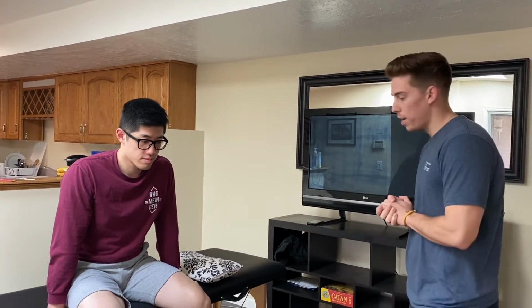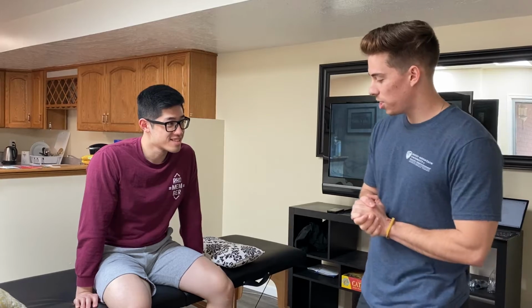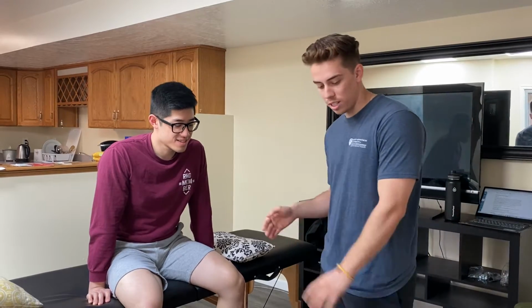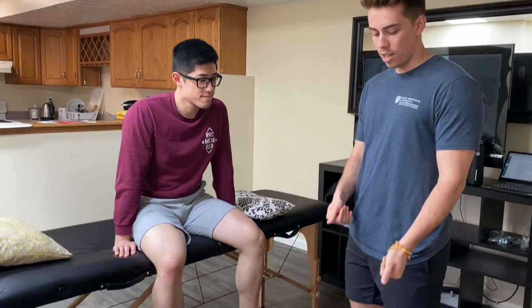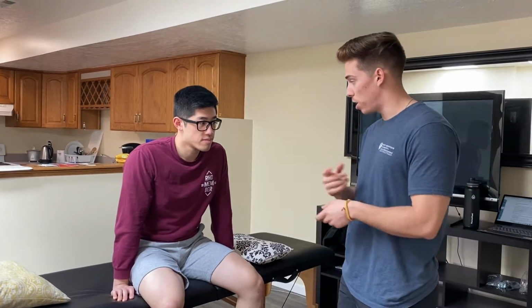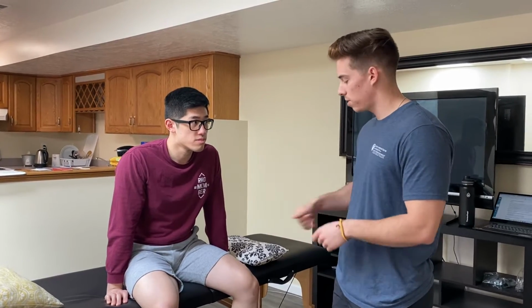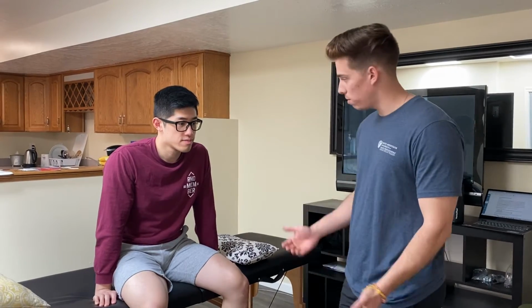So let's come over here to our patient, Will. Hi, Will. Hello. Hi, I'm Juan, student physical therapist treating you for your knee osteoarthritis. And obviously you have some pain associated with that. So today what I want to try with you is putting you on some TENS. Basically this is just electrical stimulation whose purpose is to control your pain. It does that by sending more vibration signals to your spinal cord versus the pain signals that you're currently sending to your spinal cord. So you're kind of just blocking those, and it should be relieving.